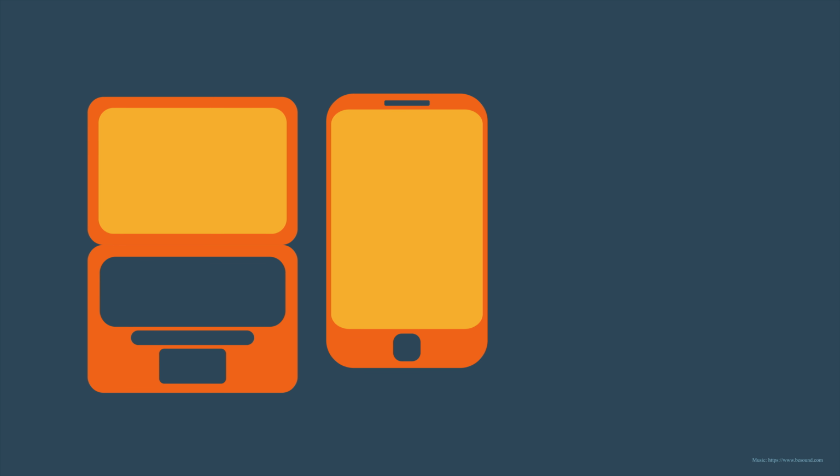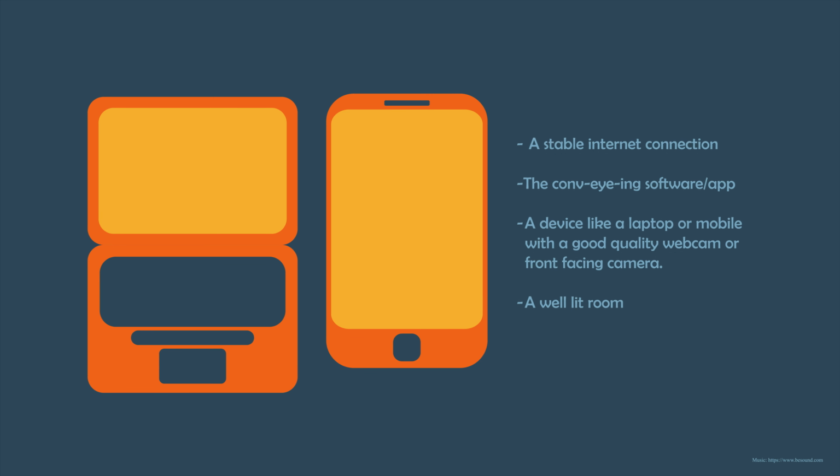What the setup requires: a stable internet connection, the Conv-Eye-ing software, a device like a laptop or mobile with a good quality webcam or a front-facing camera, a well-lit room.